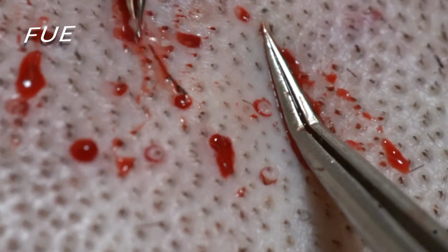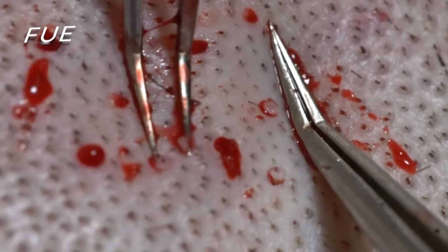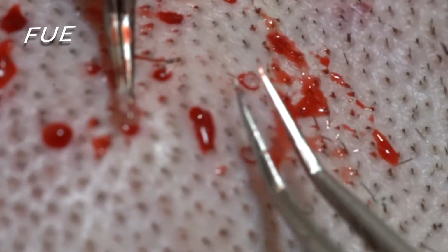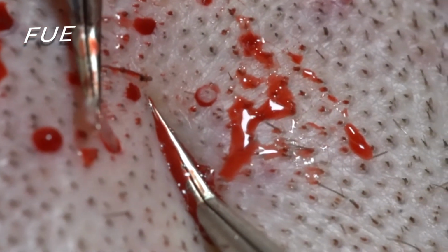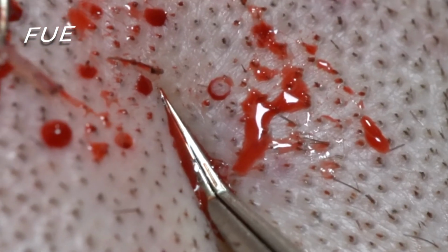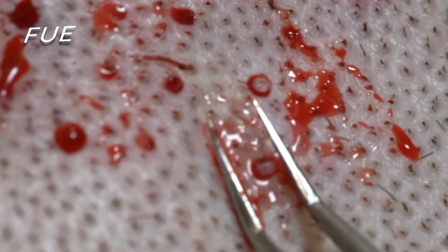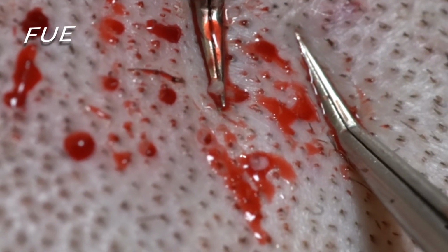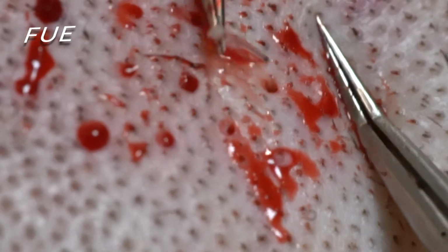We're going to try to get the second hair out. Again, we're using a little pulling motion with the tweezer. Sometimes it's easier, sometimes it's harder. And it looks like this graft is coming out almost perfectly with 2 follicles associated with it. So let's see what happens on our 3rd and 4th grafts. Again, we're pulling the hairs out with the tweezer, and there we go. We've got some great grafts. So let's see if we can get more good graft.